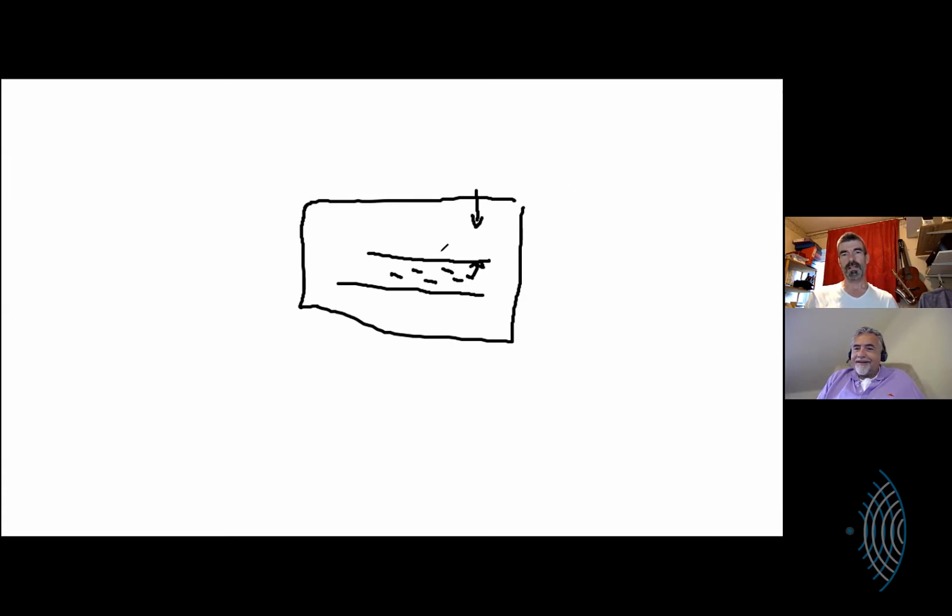If I was looking at a vessel that was horizontal on the screen, the power Doppler would show the movement more readily than the color Doppler, because all the flow is running very close to parallel to the probe, and so the color Doppler has difficulty picking it up.